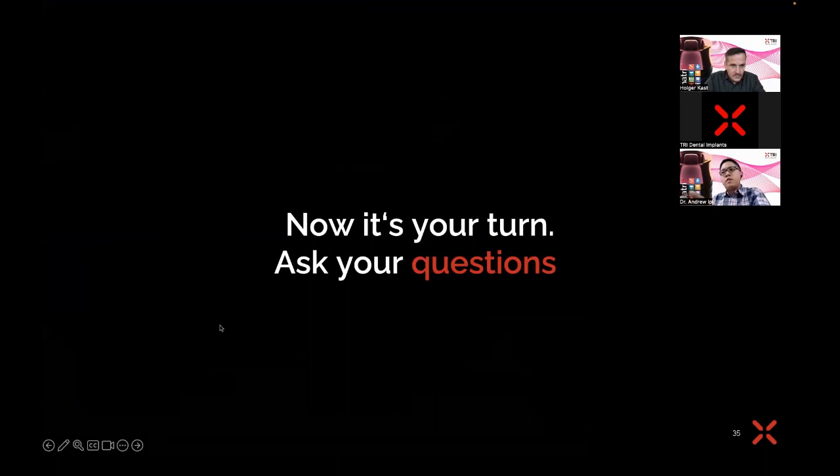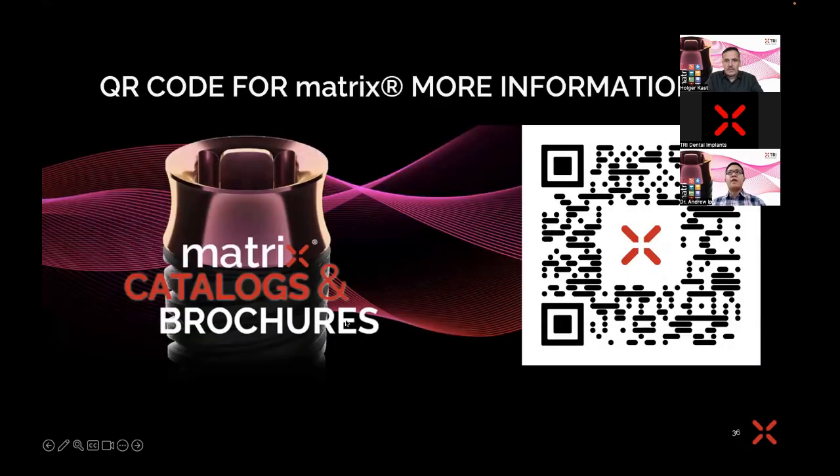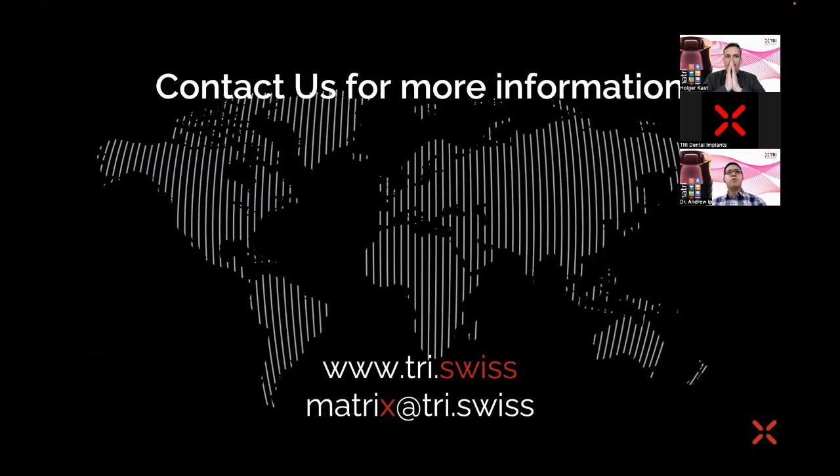Then we're also going to be talking about different things that we're going to add to our resins to make them stronger. Graphene is one of them. It has been gaining a bit of popularity these days. When you add, I think, 0.2% or 0.3% graphene to resin, you actually make it more biocompatible and stronger. So that's definitely something to keep an eye on. All these different additives are being added to resins, and all these companies are developing new resins every year. There's something new every year. They're looking nicer. They're getting stronger.